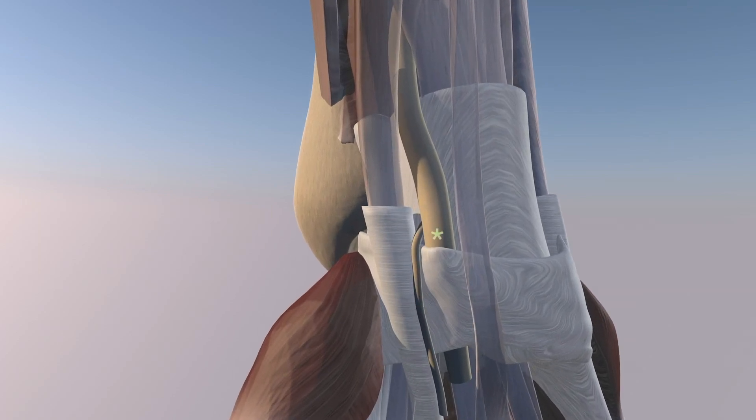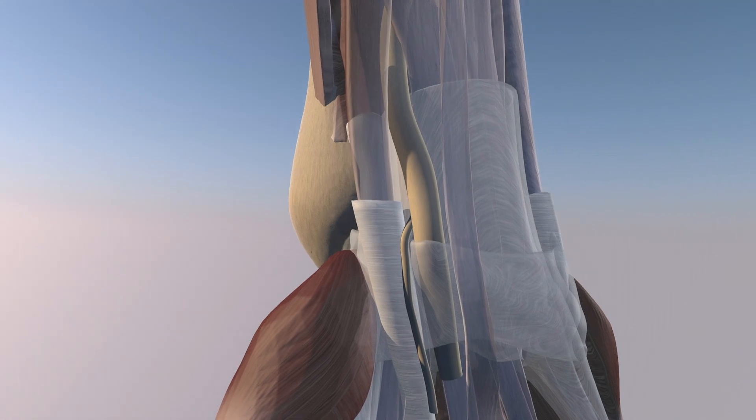Here you can see highlighted the median nerve, the flexor carpi radialis tendon, the palmaris longus tendon, and the flexor retinaculum. Now we're making the flexor retinaculum translucent — again you can see how that median nerve courses just underneath it.